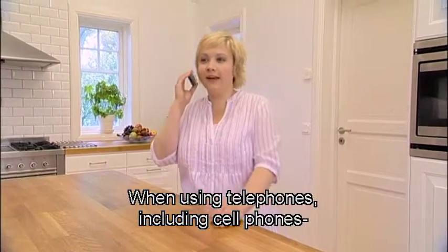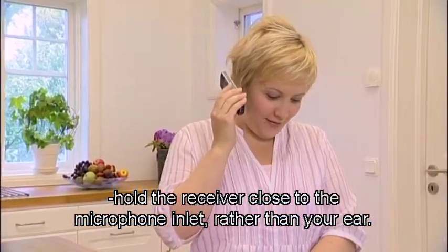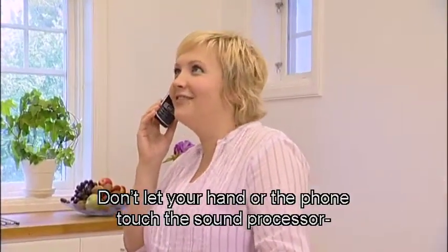When using telephones, including cell phones, try to hold the receiver close to the microphone inlet rather than close to your ear. Don't let your hand or the phone touch the sound processor, as this may cause it to whistle.